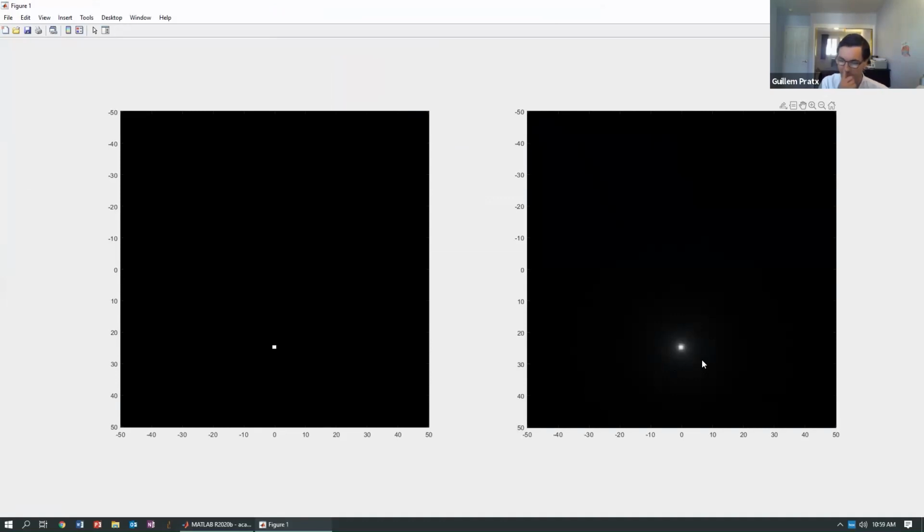So that's the blurring I was talking about, because of the lack of a filter in the projection, we end up losing some of the high frequencies. And again, that's because the projection operation will basically emphasize low frequencies versus high frequencies. And so we're losing some of the high frequency content by doing this operation, okay?